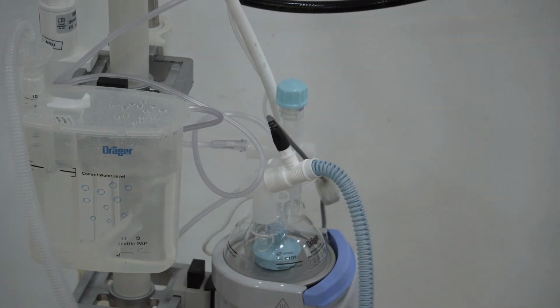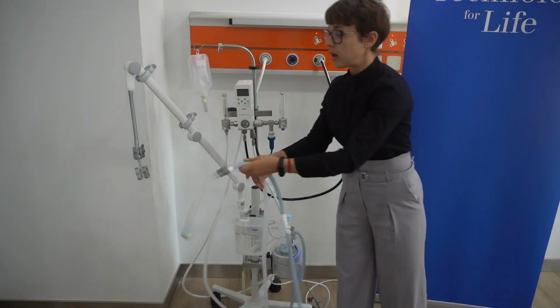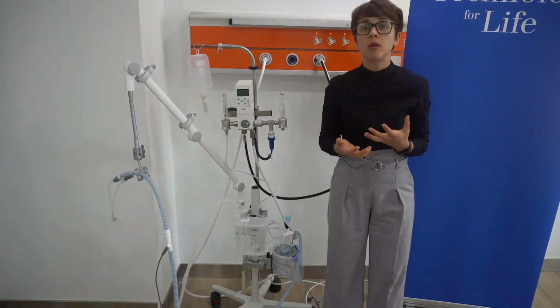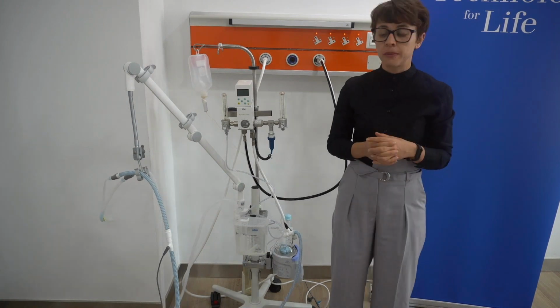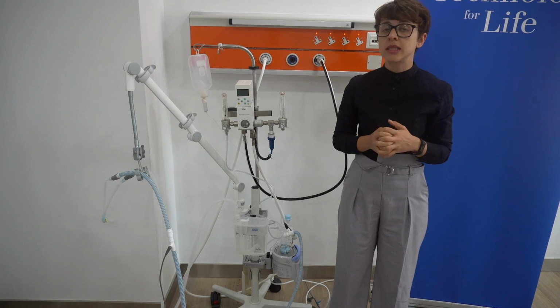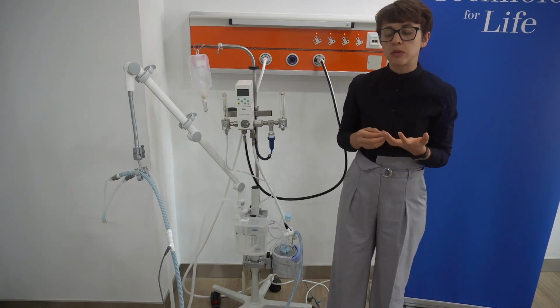So the selection of the interface is quite variable, so it depends on what you feel more comfortable with, what the baby feels more comfortable with, and I think Linda has mentioned that the high flow nasal cannulas therapy might be more beneficial or at least more comfortable.